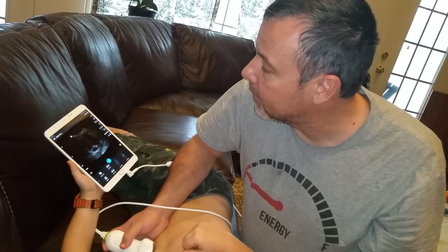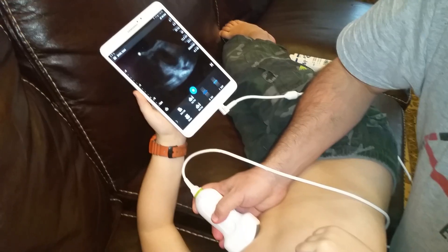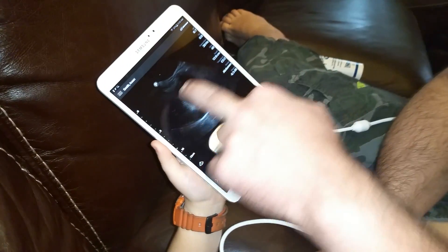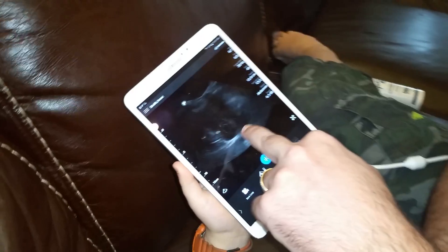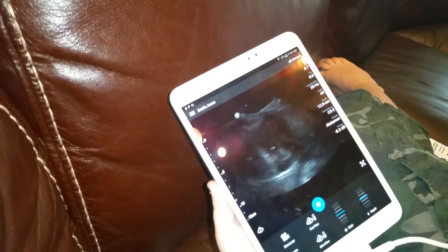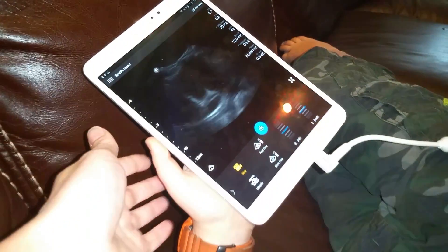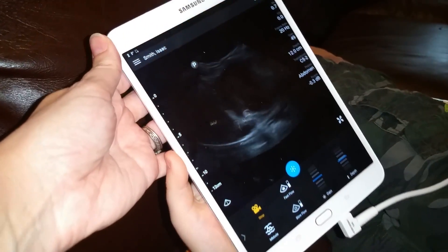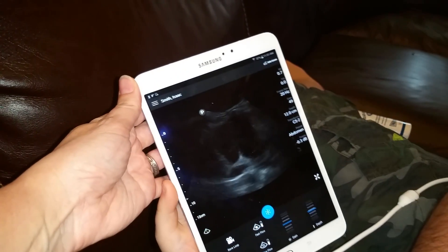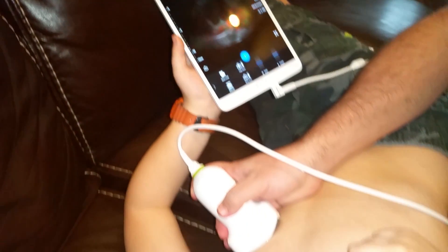This curvilinear probe is not really a cardiac probe, but it's pretty versatile. Here I've got an apical four-chamber view — you can see the left ventricle and right ventricle, and you can get a hint as to what's going on with the valvular aspect of things. You can save that clip. It's enough for a quick gross assessment of function — this is a pretty adequate view.